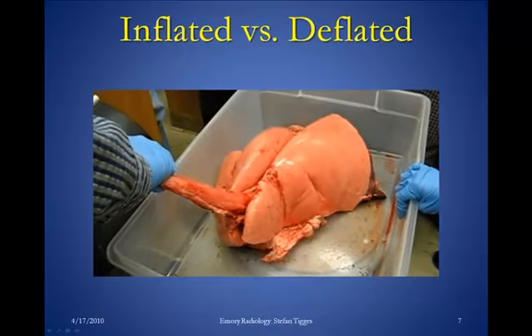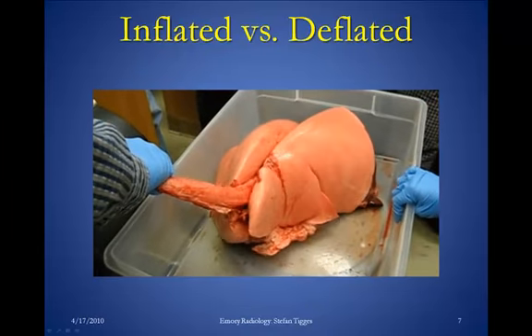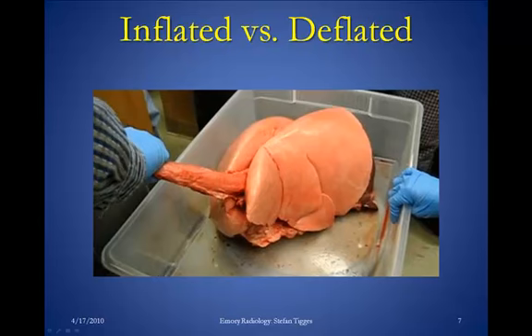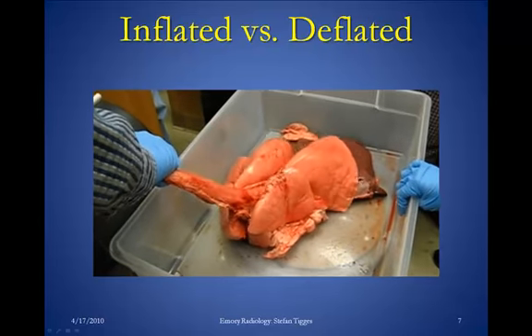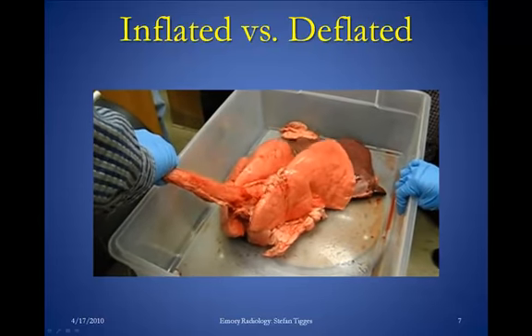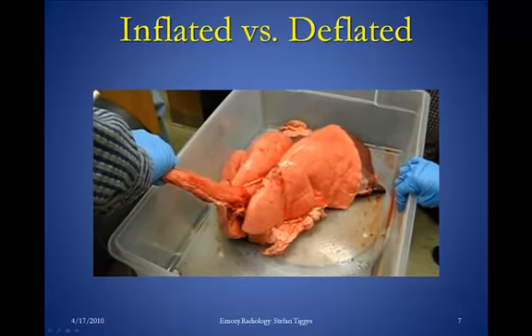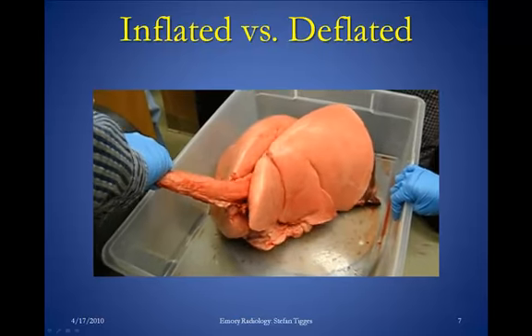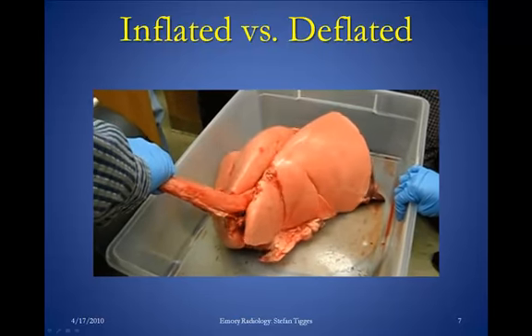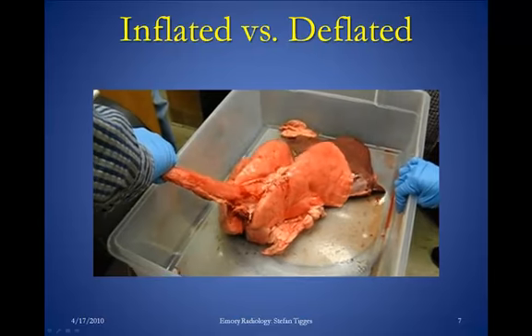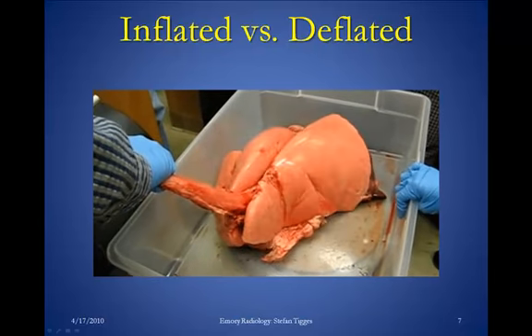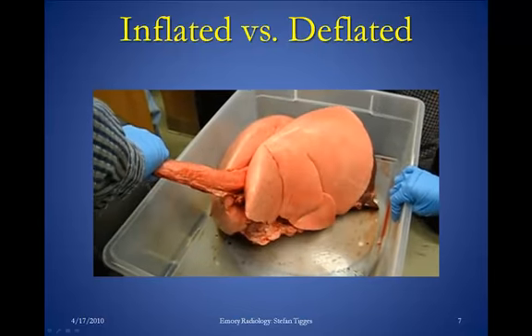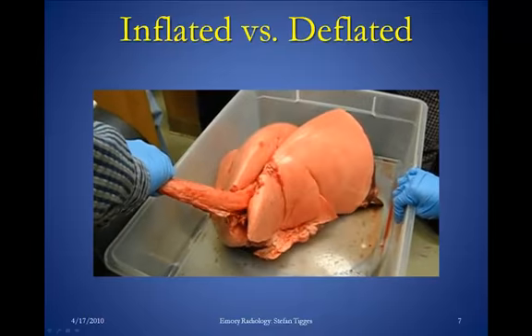Here's one of my favorite cine loops — lungs inflating and deflating. When the lungs deflate, there's less volume and they become denser, taking on soft tissue density. That's what happens with atelectasis of a lung: the lung deflates, it takes on soft tissue density, and the mediastinum shifts toward the side of the increased soft tissue density because there's less volume there.